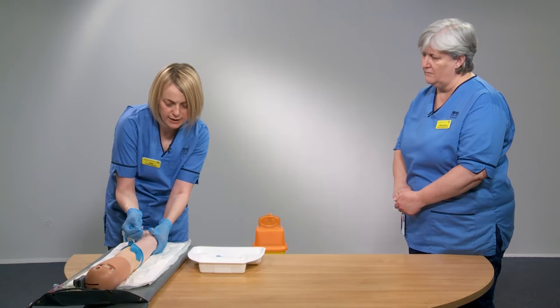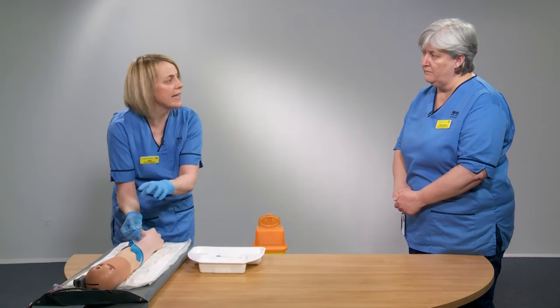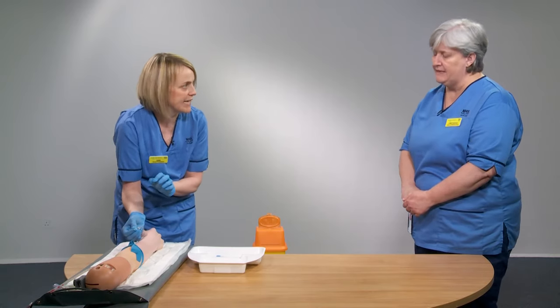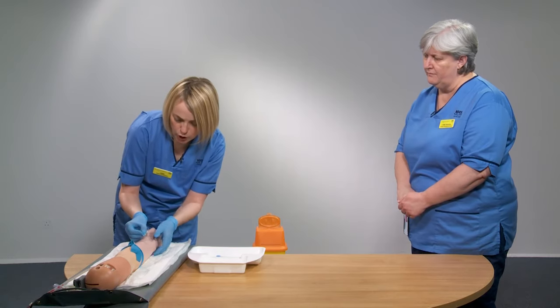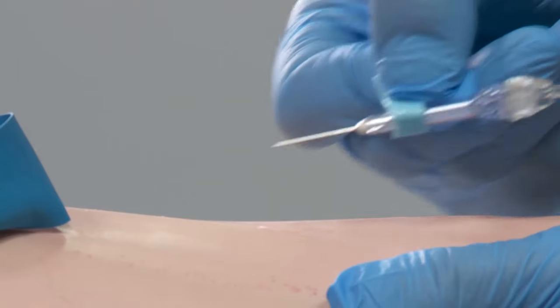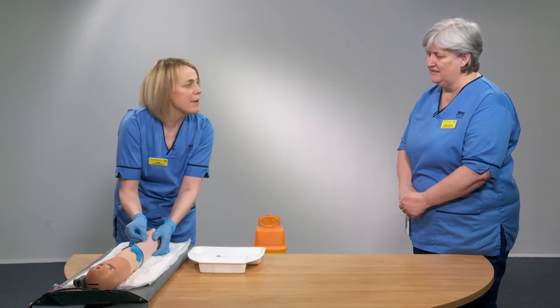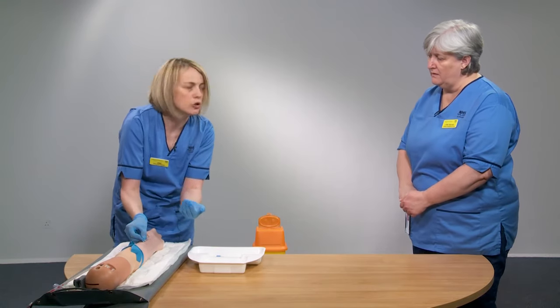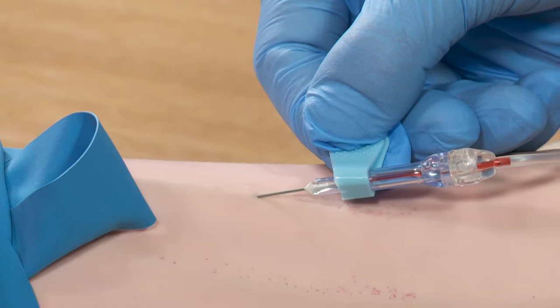With the non-dominant hand, apply gentle traction below the puncture site, keeping that hand below the cleaned area so you don't contaminate it. Enter at a 30-degree angle and watch for flashback in the chamber. Once you see flashback, you are in the vessel and do not need to advance further — the needle has done its job of piercing the vessel.